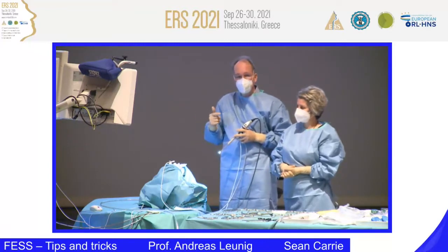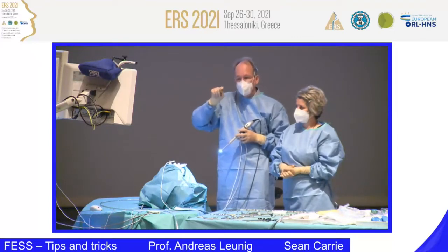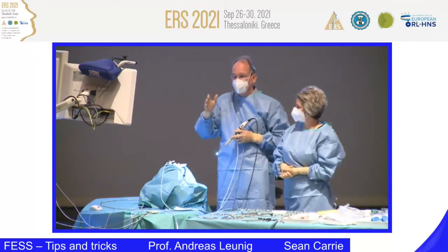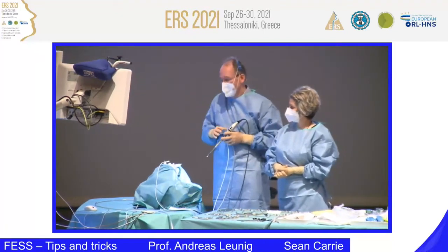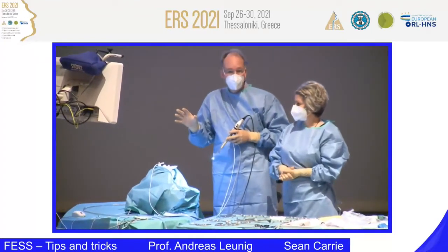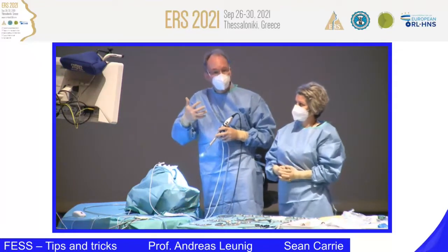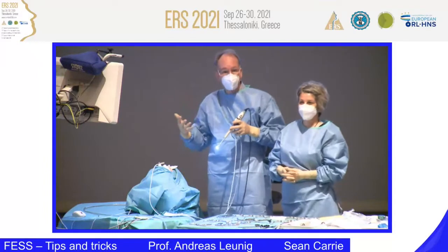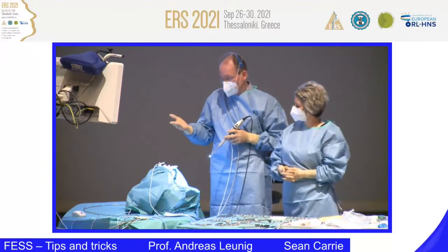So we were already using the pathway software to put in points where we can reach up into the frontal sinus, left and right side. We will see how much we can dissect, as well as into the sphenoid sinus. We also have the option for powered instrumentation. It's the shaver, which makes sense in cases with nasal polyps, maybe tumors, inverted papilloma, or even when you have to drill. And there's a new drill system here.